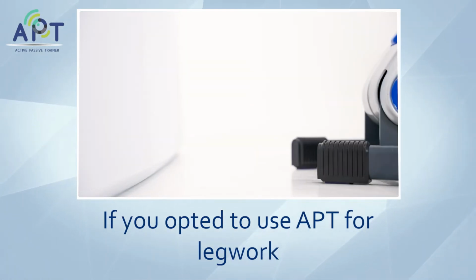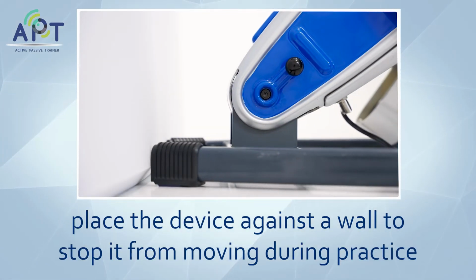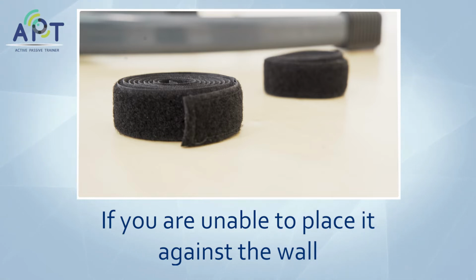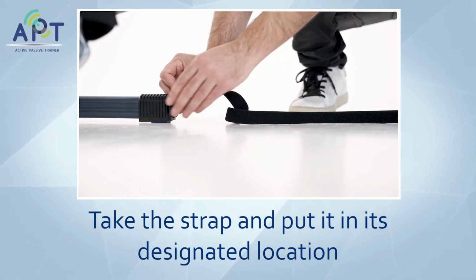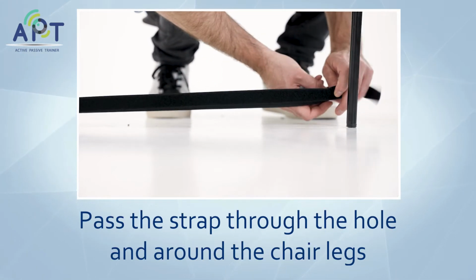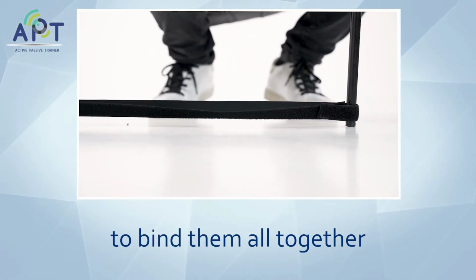If you opted to use A.P.T for legwork, place the device against a wall to stop it from moving during practice. If you are unable to place it against the wall, use the black straps that come with the box. Take the strap and put it in its designated location on the near side of the A.P.T's legs. Pass the strap through the hole and around the chair legs to bind them all together.